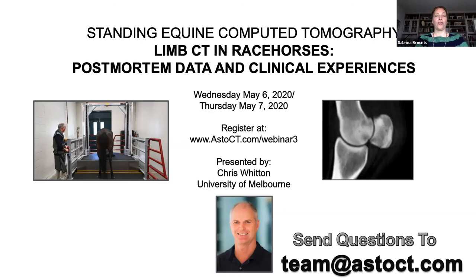There was another question: do you do myelograms? Yes, we have done some myelograms, not standing, but under general anesthesia. That was discussed in the first talk, the last time that we did it. And you are able to see the myelograms really nicely with contrast.